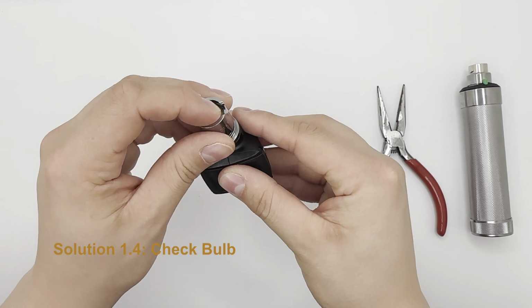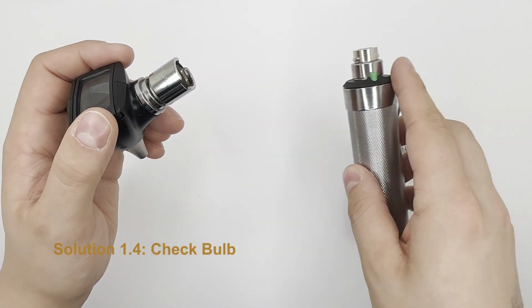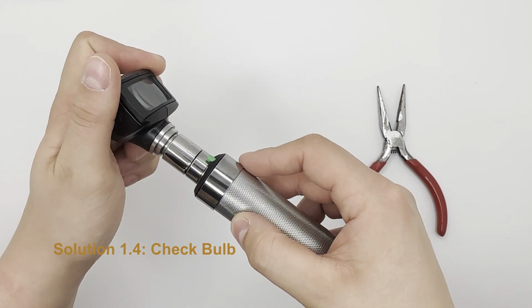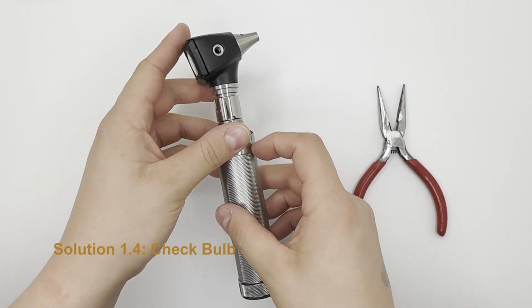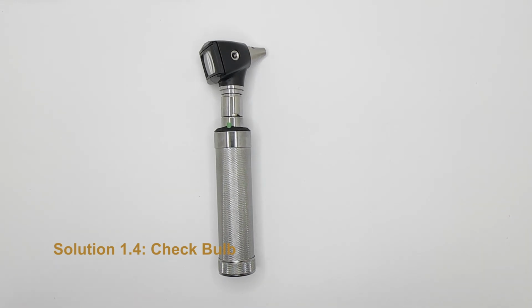Many scopes come with bulb replacement, or bulbs can be ordered online. Ensure that the type of bulb matches the scope specifications, since scope bulbs can be halogen, xenon, or LED bulbs. LED bulbs typically last 7 years. Place a new bulb back into the base of the head and put the head of the scope back on the handle.